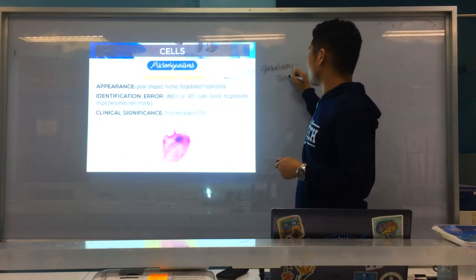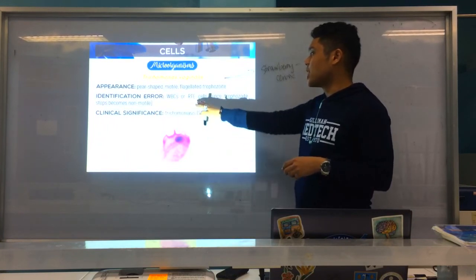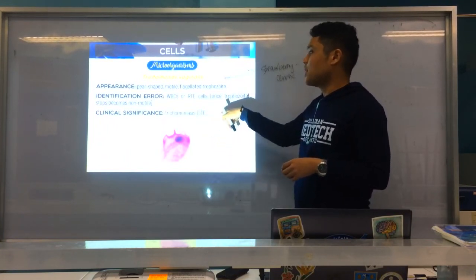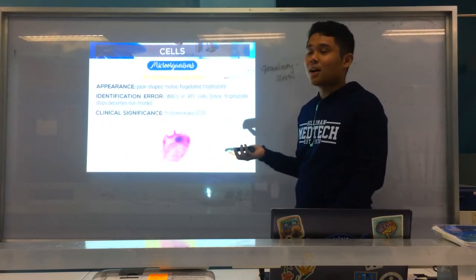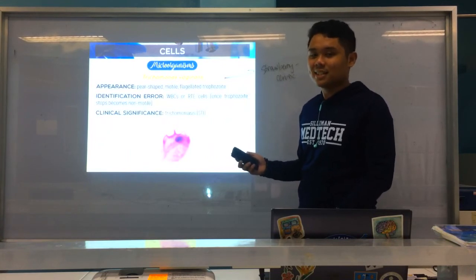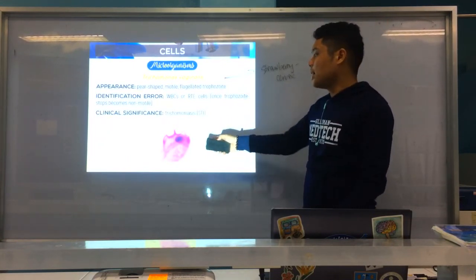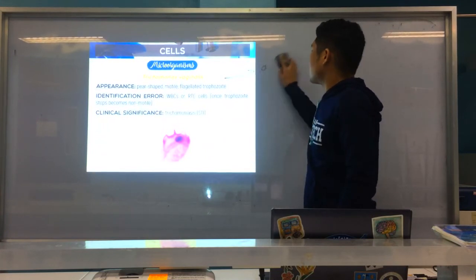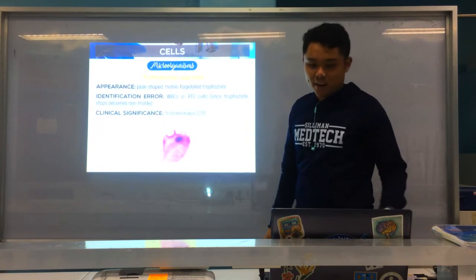Diba? Strawberry cervix. Naka-remember pa ani? T. vaginalis. Again, identification error could be WBCs or RTE if the trophozoite becomes non-motile. Sir, na-ay cyst ang trichomonas? Nako, sinasabi ko sa inyo. Walang cyst ang trichomonas, guys. Wala siya'y cyst. Troph ra gyud siya. Okay? Ang trichomonas. Trichomoniasis. Trichomonas vaginalis. STI. Or a sexually transmitted infection.